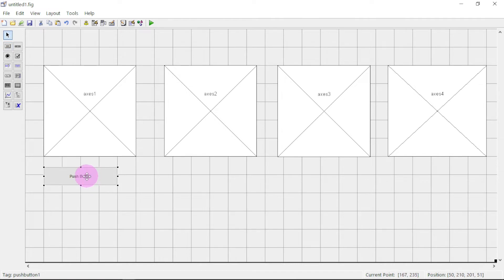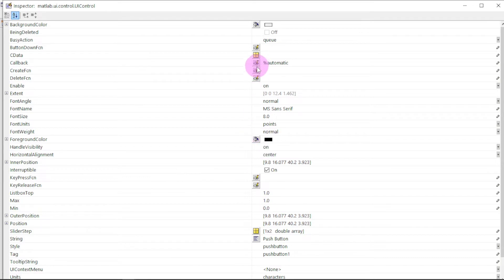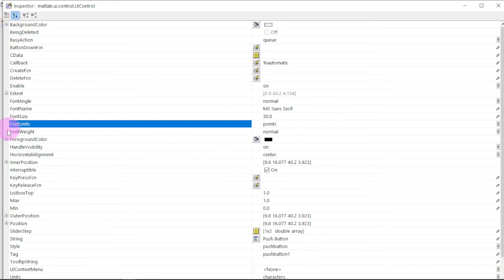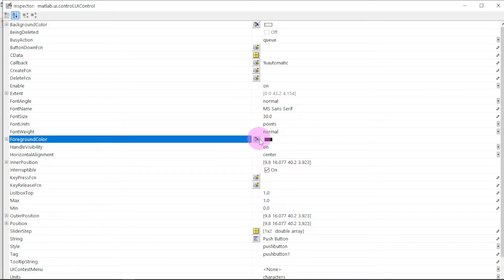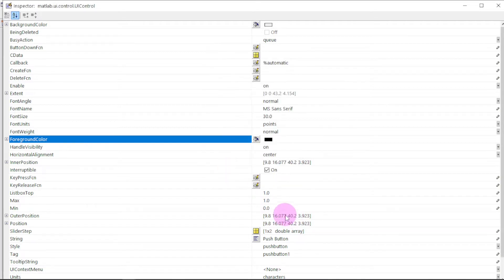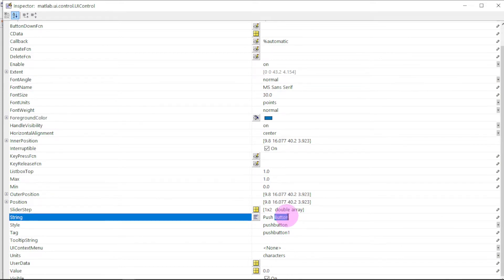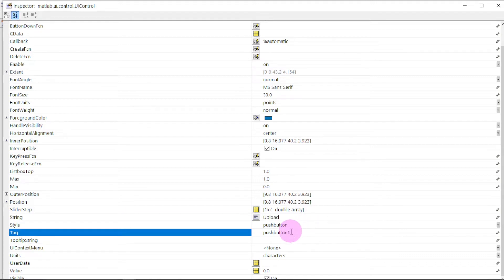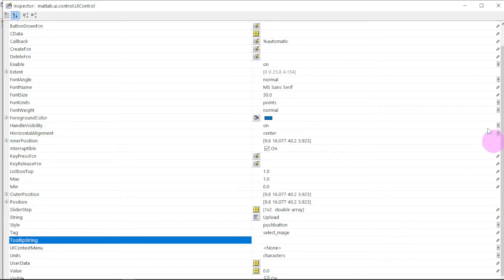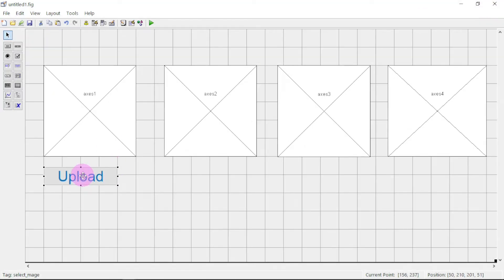Now let us edit this push button. We need the font — let the font be 30. Then the foreground color — let's change it to blue. Then we come to the label: this one will be 'Upload Image'. Then the tag — that will help us in programming to easily identify which push button we are working with. Then we close.